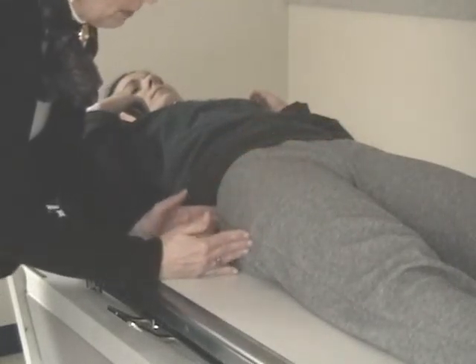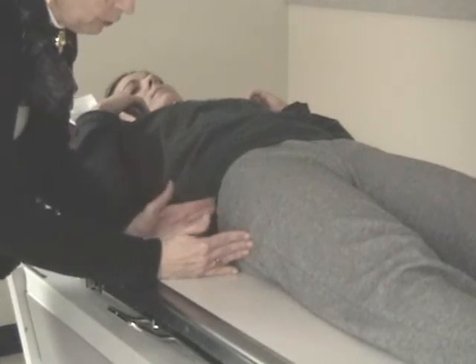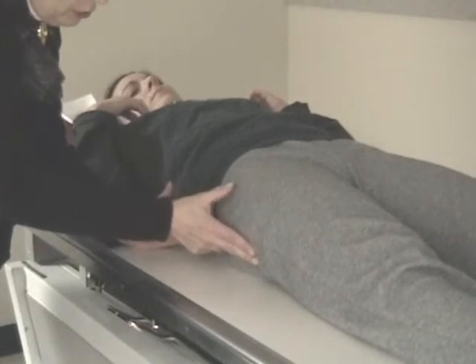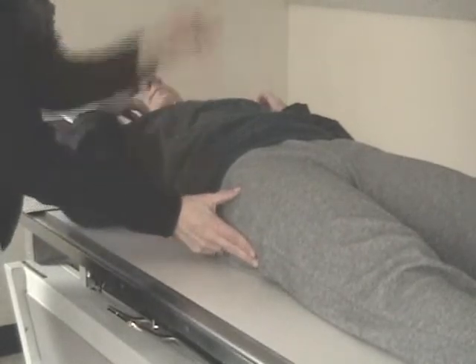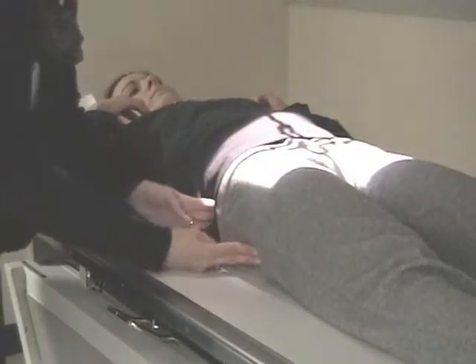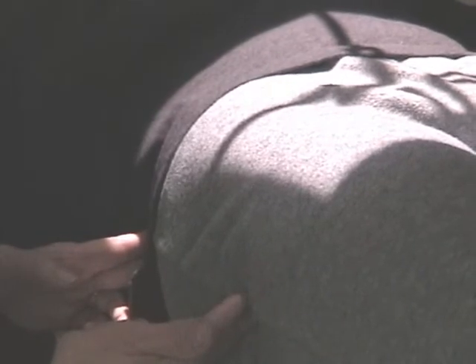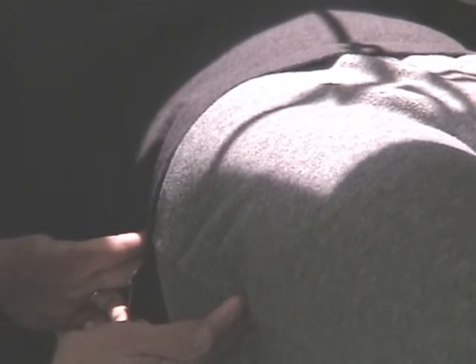So I'm identifying the superior border, I'm identifying the inferior border of the pelvis, and the center crosshair should be right here. You can see how that light is not centered over my fingers. So I need to float the table.